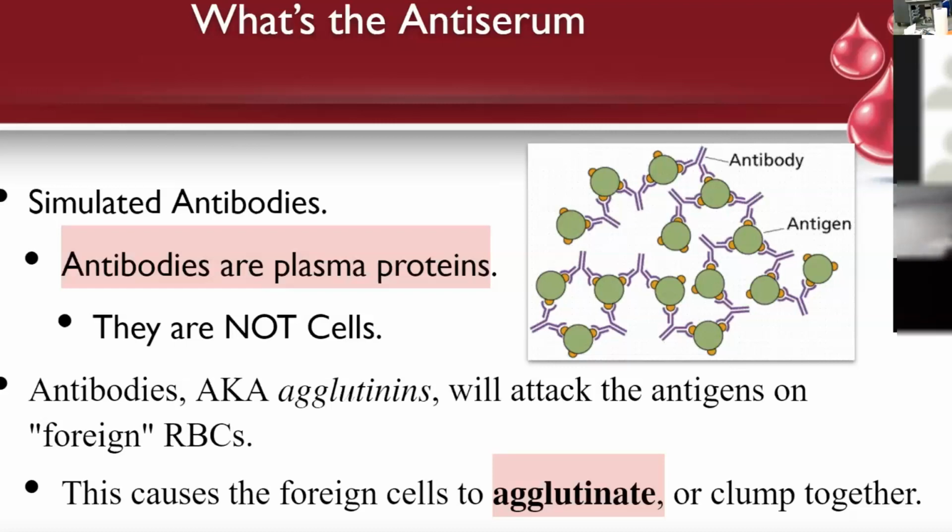And for efficiency's sake, because we will be sharing chemicals and we'll use wipes in between, I think you're most efficient if you do each of your blood samples, shoot, get the next blood sample, shoot, the next one, shoot, get your blood samples done, and then go through your RH, A, B assembly line. Then you can use a stick if you need to mix them together. I don't want to contaminate my sample, so did you notice I flipped my stick in between? You can flip your stick and get 2 uses out of it, or just grab another one.